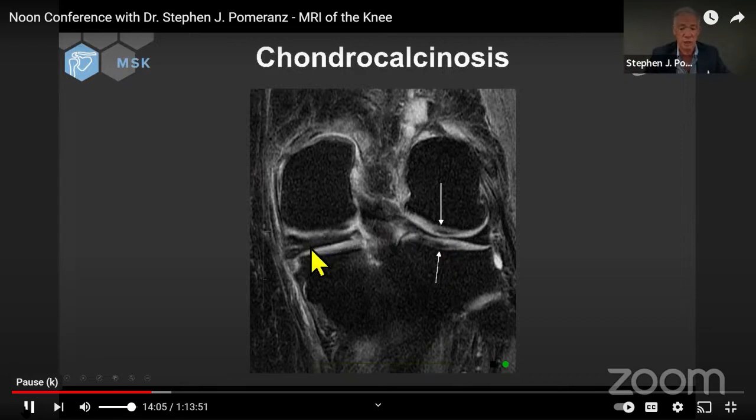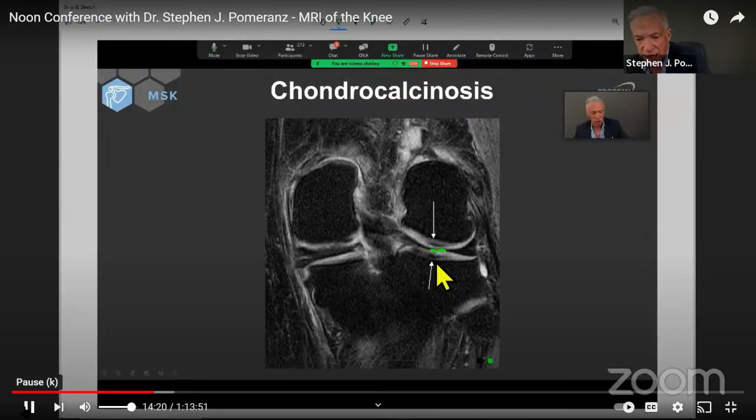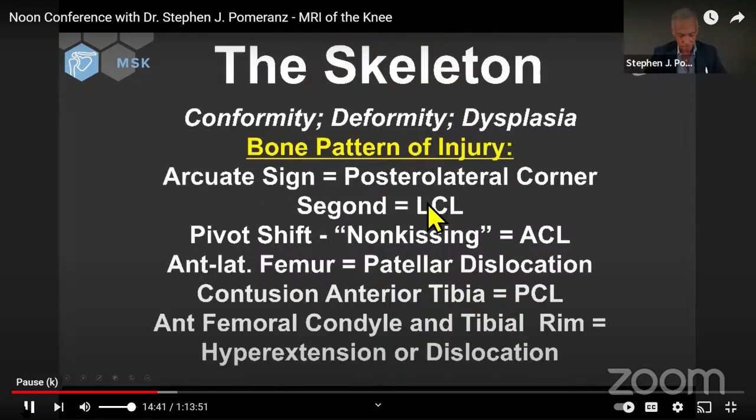And that's because this patient has the entity known as CPPD, calcium pyrophosphate dihydrate deposition disease. And sometimes you'll see something very similar to this, but it'll be a little bit more superficial, kind of like here, or there'll be little dots that are more superficial rather than in the interstitium of the cartilage. And this is known as the icing sign associated with gout. So superficial hypointensity, gout; interstitial, mid-cartilage hypointensity, chondrocalcinosis, or CPPD deposition.